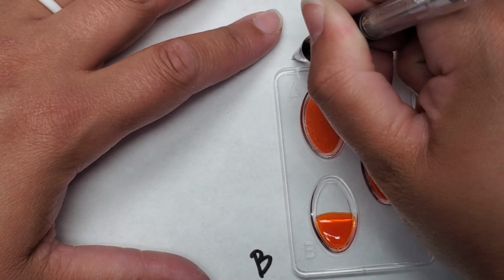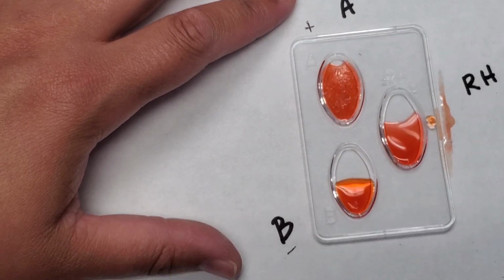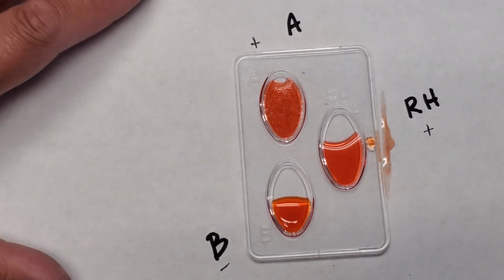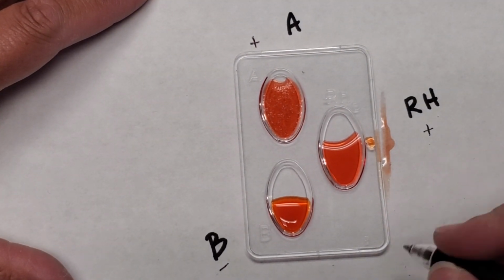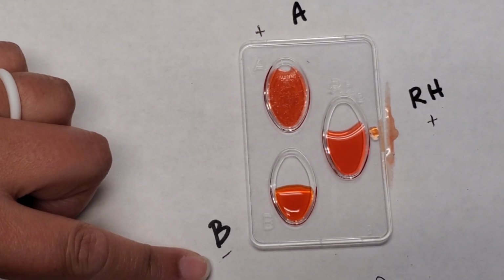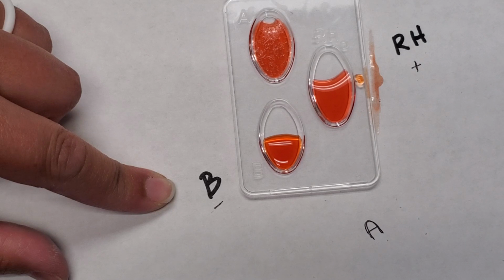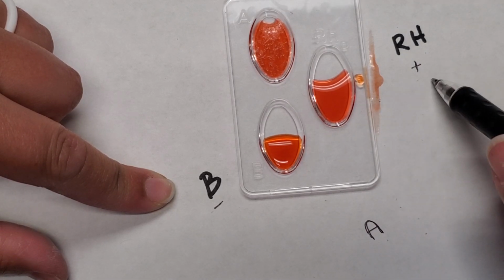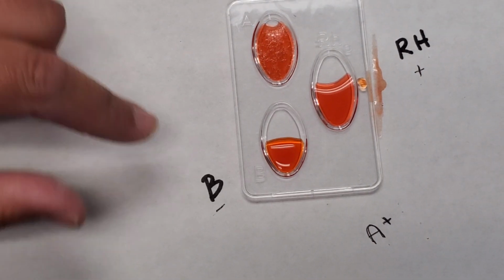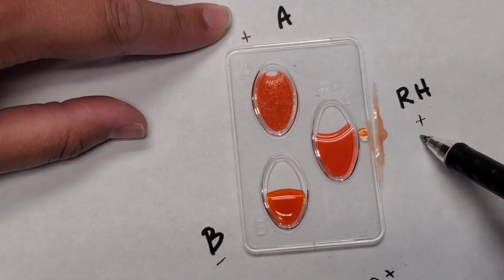So that's telling me that I have a positive result in the A well, a negative result in the B well, and a positive result in the Rh well. So what in the world does that mean? It means that antigen A is present, so we know that it has antigen A in it. Antigen B is absent. So if antigen A is present and antigen B is absent, so far we know that we have a blood type of A. The Rh well showed a positive agglutination, which indicates that we have a positive blood type. So again, we have a positive in the A well and a positive in the Rh. That gives us a blood type of A positive.